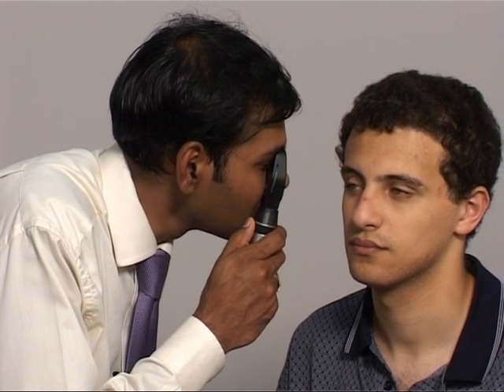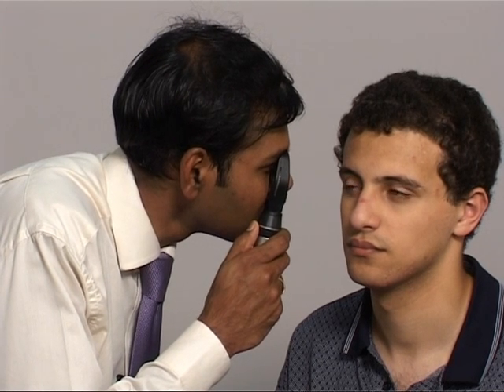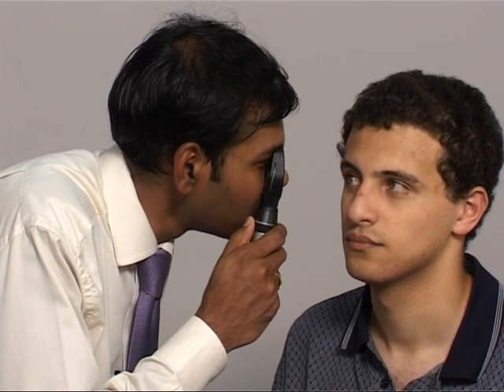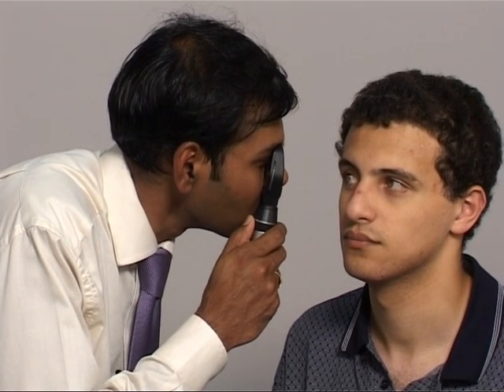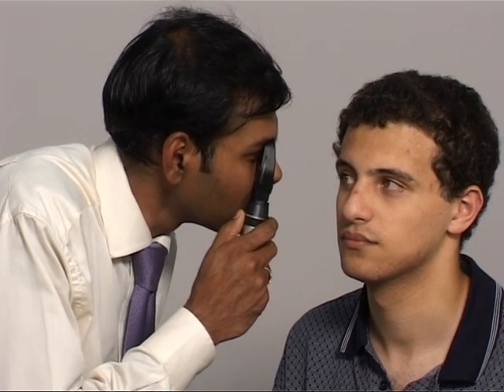After having done that, you can ask the patient to look directly into the light. Can you look into the light, please? And this brings the macula into sharp focus. Thank you. You may then want to repeat the same process for the other eye.